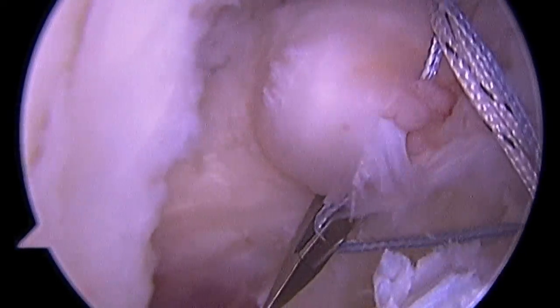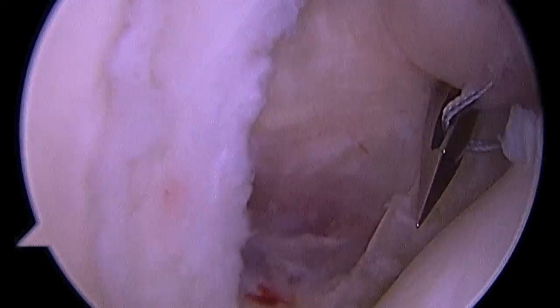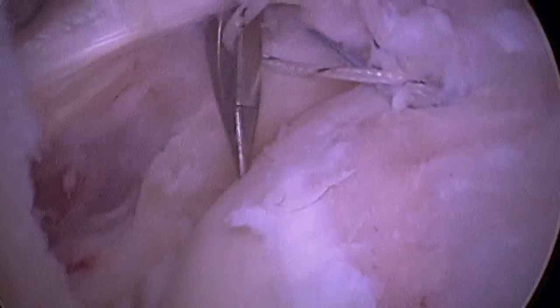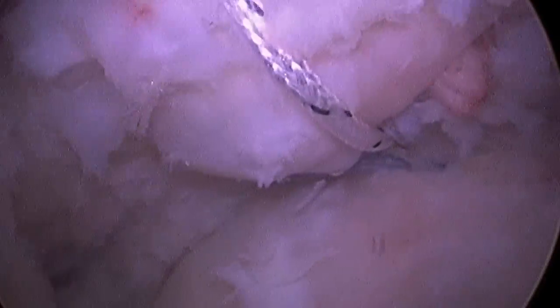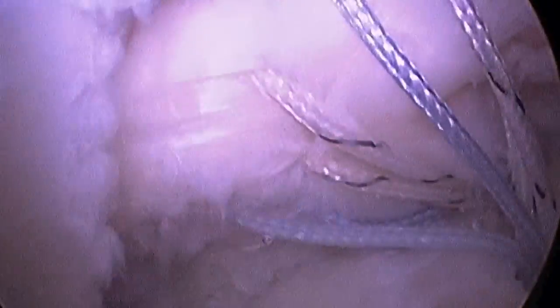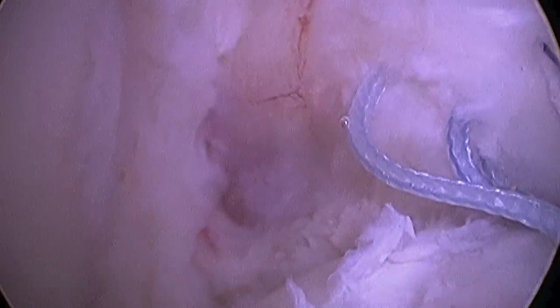I've placed an anchor in the lesser tuberosity bone in the front of the shoulder. That anchor has four stitches on it, and I'm going to pull them through the tendon at the site I think is most appropriate. There you see one anchor in place with all the stitches passed. There you see a second anchor in place. Now I've got eight sutures going across that tendon with two anchors in the bone.